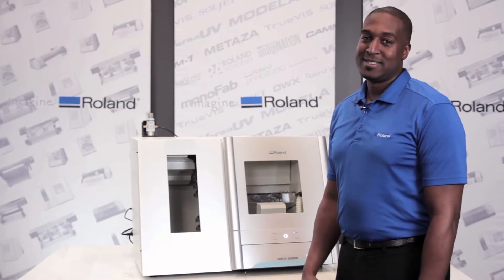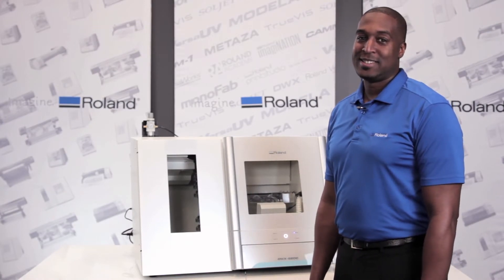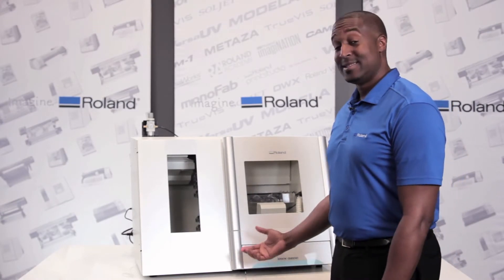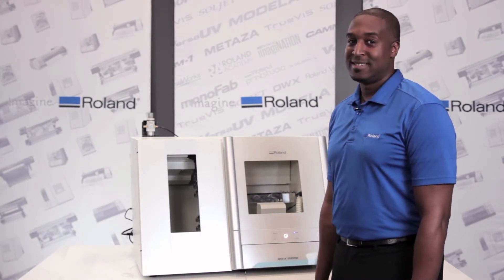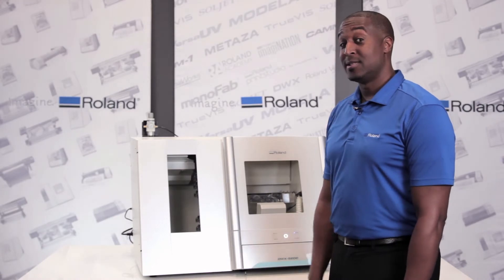My name is Dwight Blair, Dental Product Manager here at DG Shape by Roland, and this is the DWX52DC 5-Axis Dental Mill with an automatic disc changer.